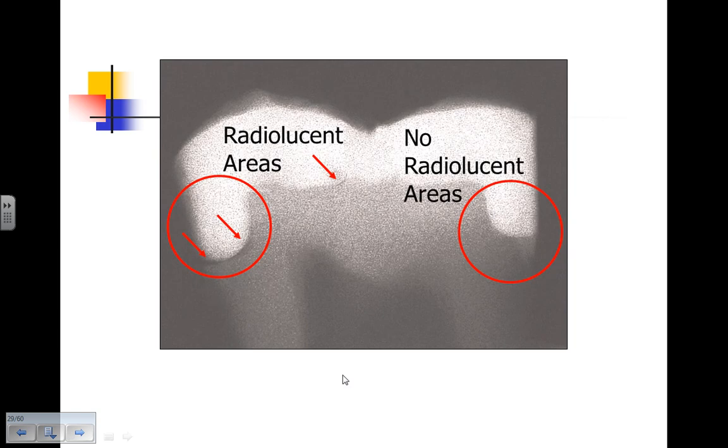Light cure the adhesive for 20 seconds. When you light cure the adhesive, one of the problems that can occur is if the adhesive is pooled at the gingival margin. Look at the left-hand side. This is an extracted tooth where a composite's been placed, and the adhesive was allowed to pool and be thicker where it was up against the matrix band. It has the appearance of recurrent caries, versus air thinning the adhesive, not allowing it to pool, shows us that the composite's well adapted at the gingival margin. It sometimes leads to the incorrect diagnosis of recurrent decay.